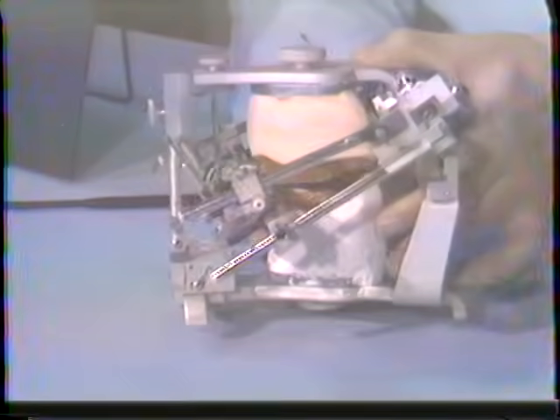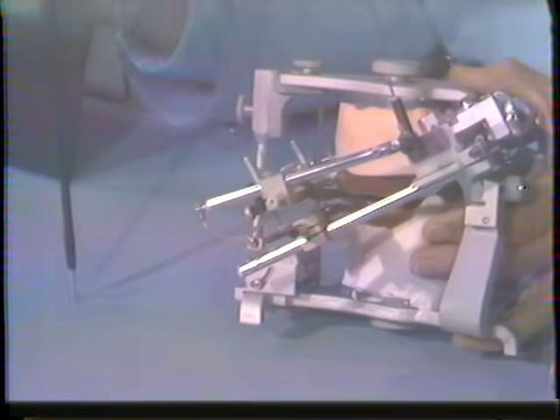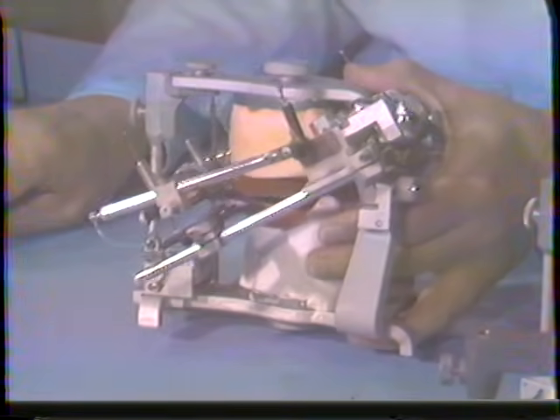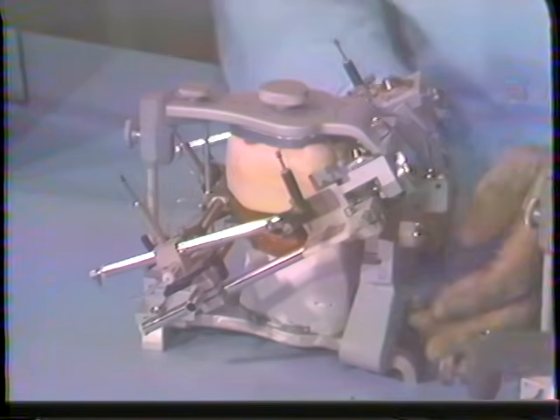However, if the bases can be secured well in the mouth, so that they're firm, a patient with good ridges, for example, and the central bearing point can be placed accurately enough so not too much tilting of the bases occurs on the soft tissue in the mouth, one could make a pantograph tracing as shown here.